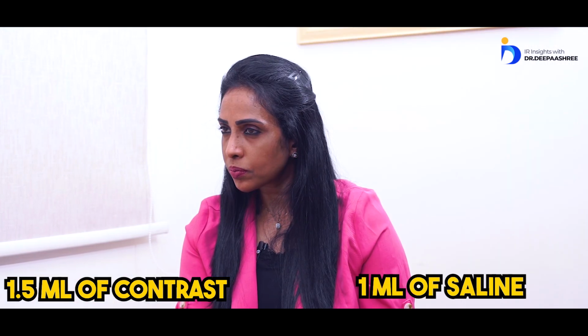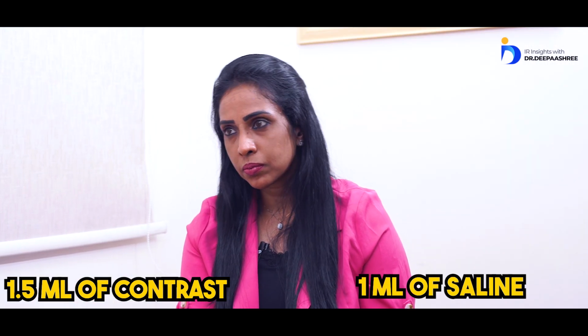In terms of the PVA particles, what is your mixing protocol? How much contrast do you take, and what type of contrast? I always take neat contrast. I don't mix the angiographic contrast, unlike what we already mix, 1:2 with water. I always take neat contrast, and I have the saline there. Take 1.5 ml of contrast, 1 ml of saline. See how your mixture is. If the ratio is good, then I keep the same ratio and dilute the entire amount.